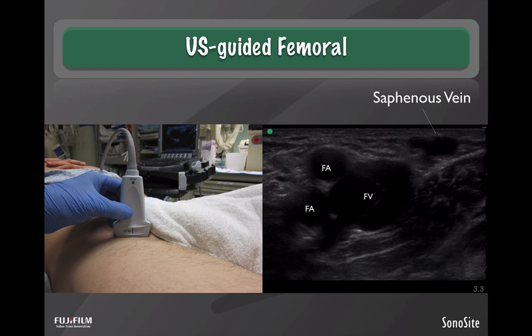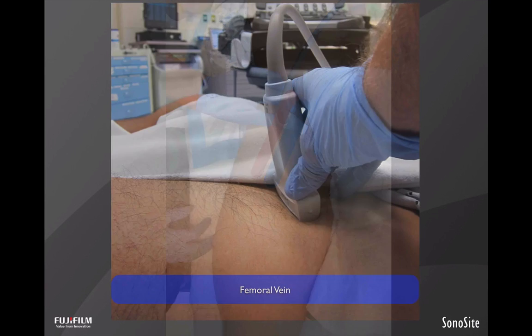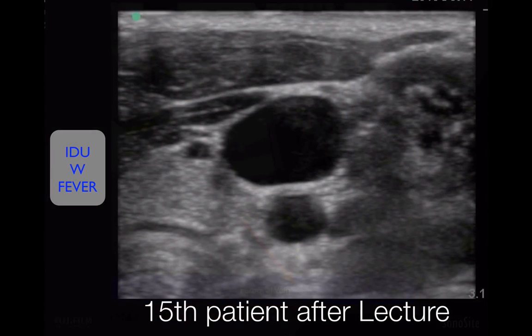So here you can see you have a great femoral vessel. You're aiming up towards the umbilicus. And again, artery and vein aiming toward the umbilicus. And again, the same idea. You can do that same technique. Measure the distance down, measure the distance back, the same amount, and come in a steep angle and puncture the femoral vessel. I think this works the same way as the internal jugular vein.